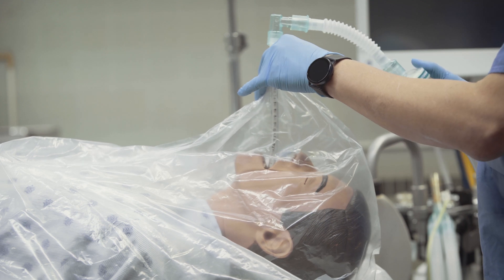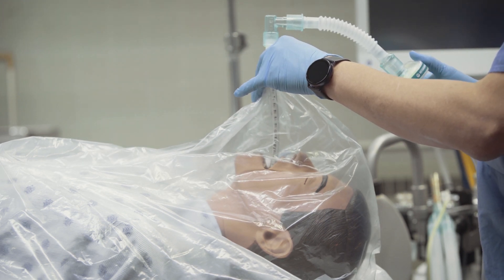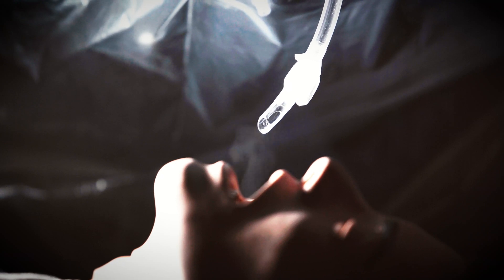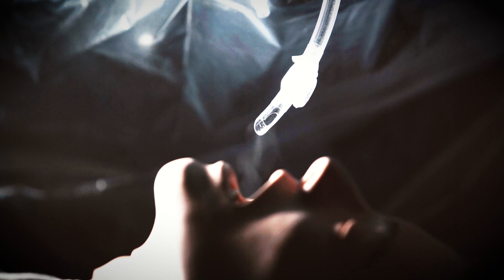Here we use small droplets generated by a nebulizer to demonstrate the principle of containment of droplets using suction through the trachea tube. Although there are limitations to this demonstration, this negative pressure model shows that the risk of small droplet exposure during extubation can be reduced.